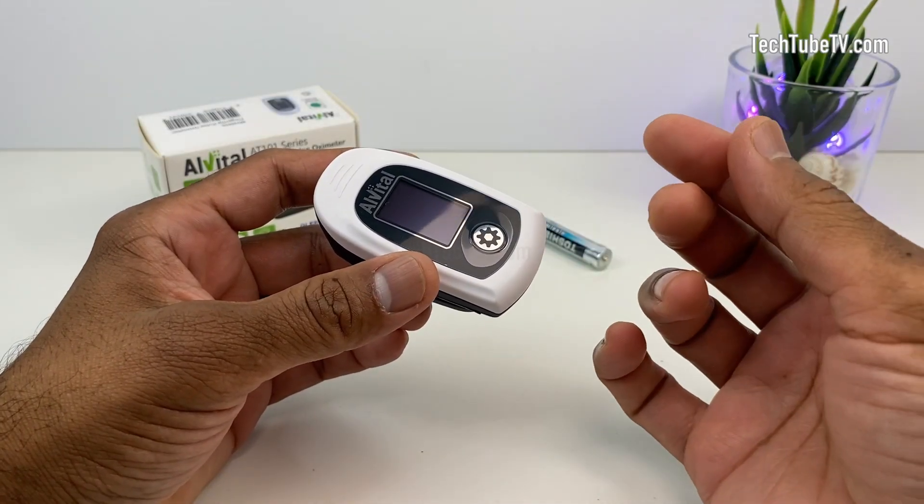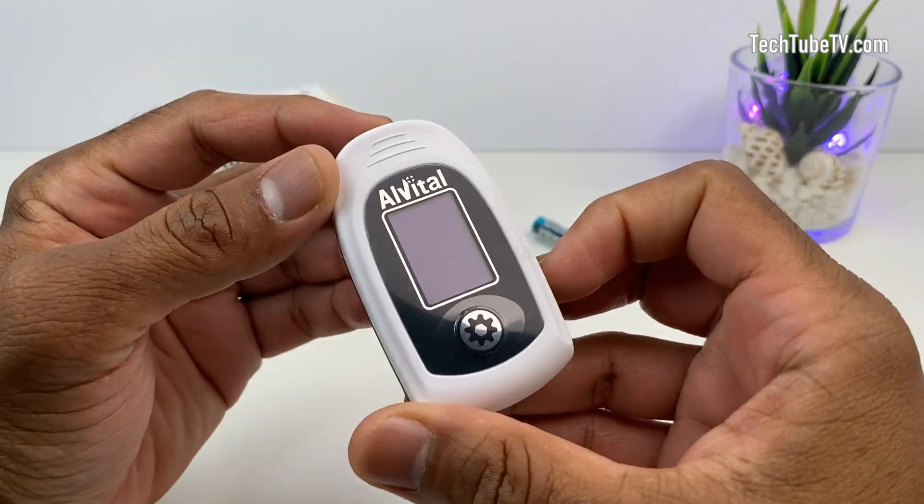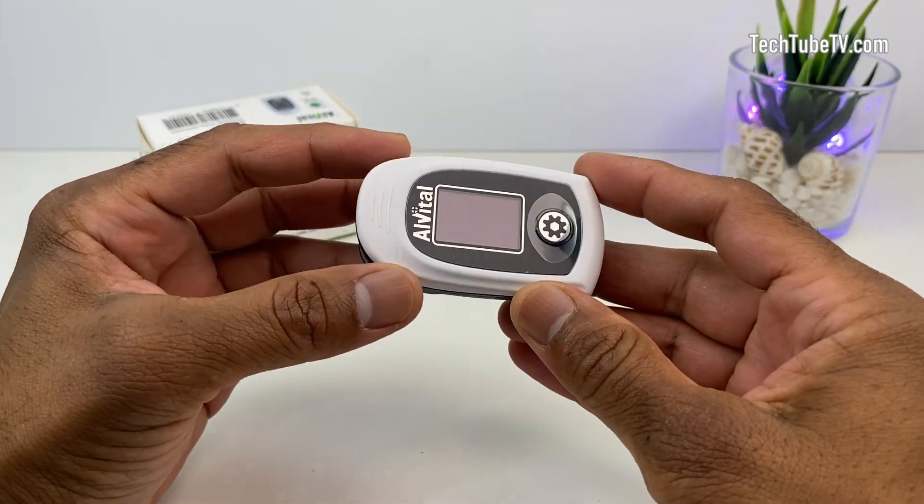Pulse oximetry is a measure of how much oxygen is in the blood. Using this Alvital pulse oximeter, you can measure your blood oxygen saturation and pulse rate.